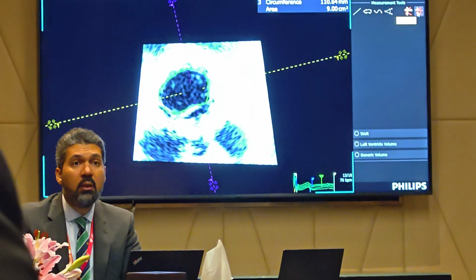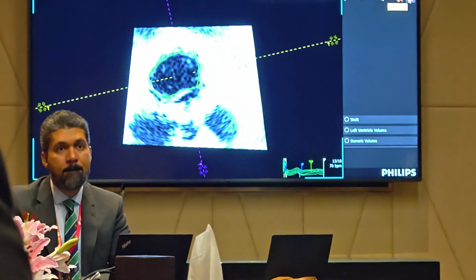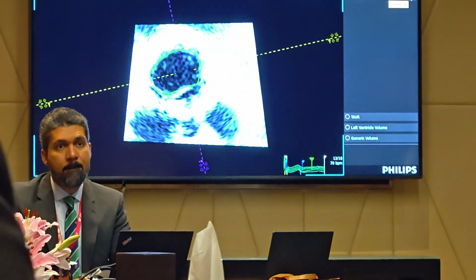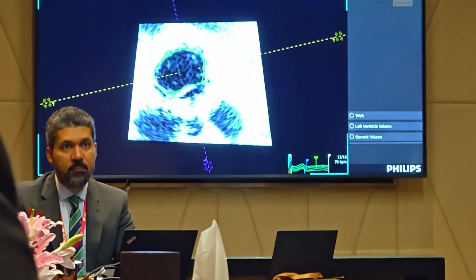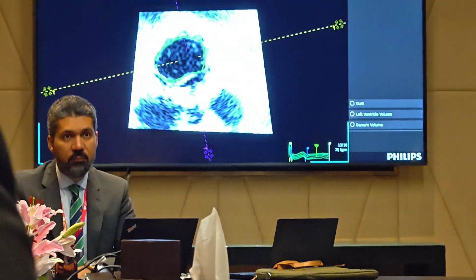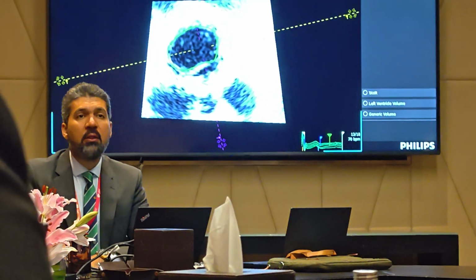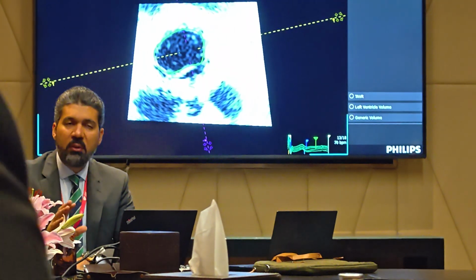Dr. Hani, one question. Yes, please. This mitral apparatus is funnel shaped. At what point are we supposed to measure the area, the tips? The tips of the mitral valve. Because a lot of the time when it is opening in diastole, the chordae also get attached. It's mainly in mitral stenosis. Yes, in mitral stenosis, yes.